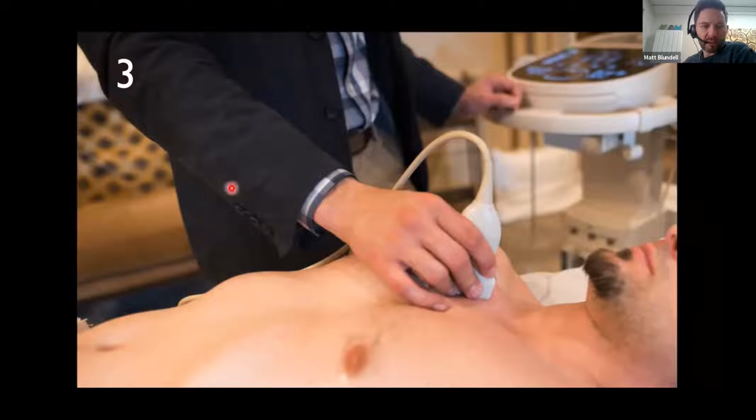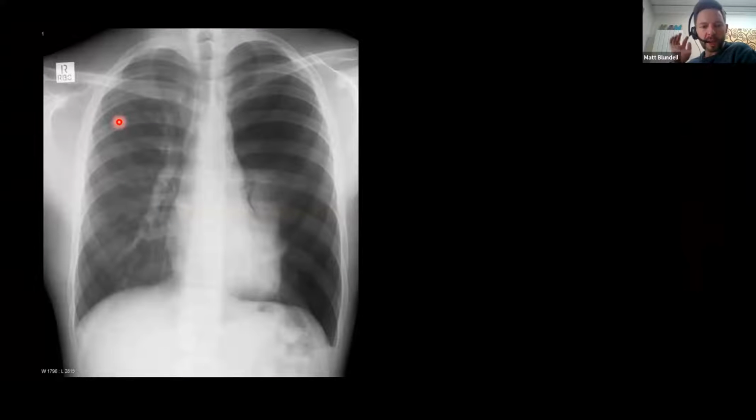This is what caused a bit of heartache, certainly amongst some of our emergency medicine colleagues, because everyone's not particularly savvy using ultrasound to diagnose pneumothoraces, let alone use it to identify the site for inserting the chest drain. But hopefully by the end of this talk, you'll feel a lot more confident in being able to do that, and it's really not that difficult. So we'll segue a little bit into how to diagnose pneumothorax to start with.